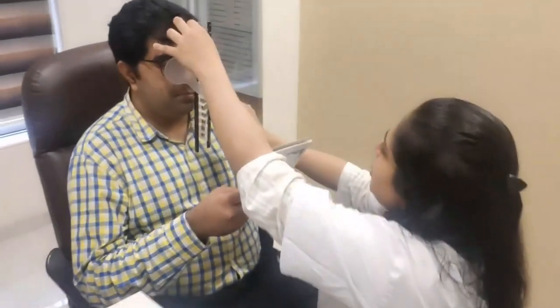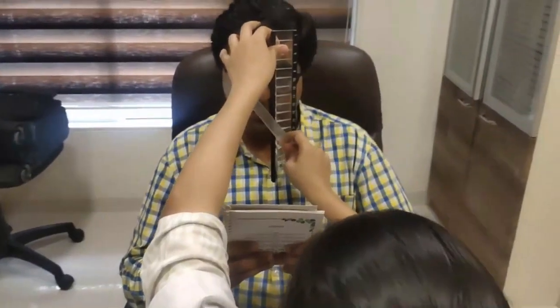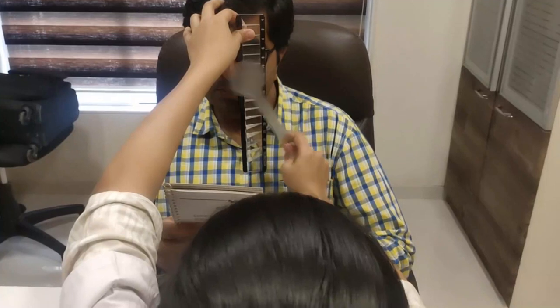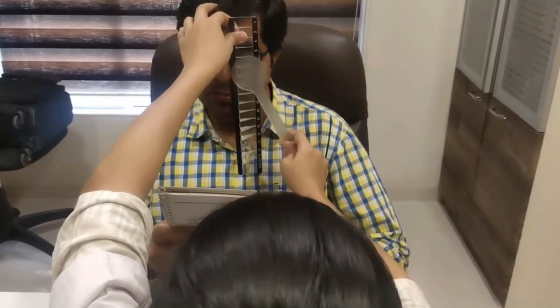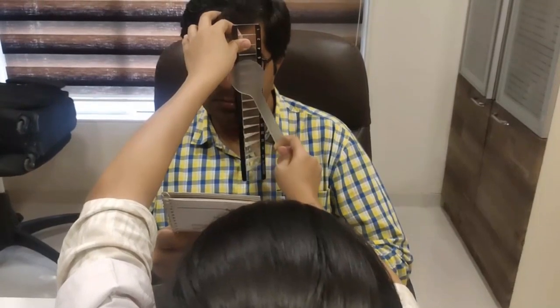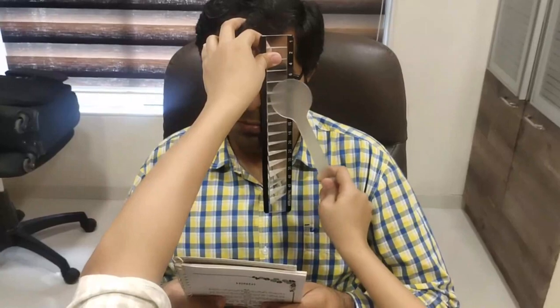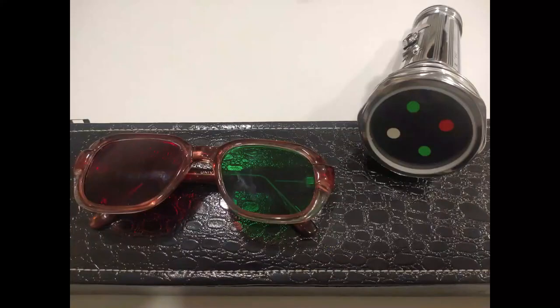On doing a prism cover test with glasses with apex towards the deviation, we can see that at 8 prism diopters, there is no movement of the eyes seen and the eyes are properly stabilized, which shows 8 prism diopters of exophoria for near. Let's check for suppression, in case any is present, for near.